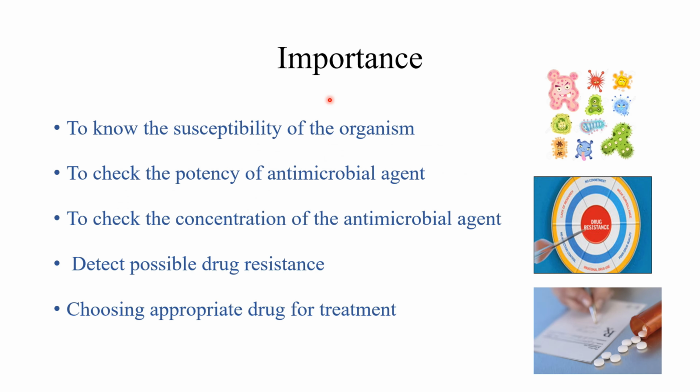Antibiotic susceptibility test. The importance of antimicrobial susceptibility testing is to know the susceptibility of the organism, that means whether the organism is susceptible to a particular drug.